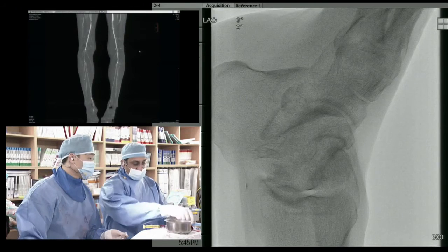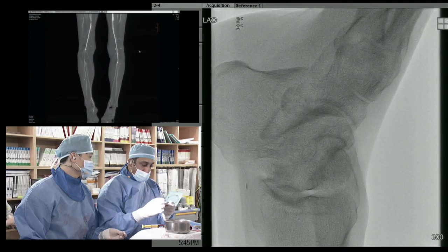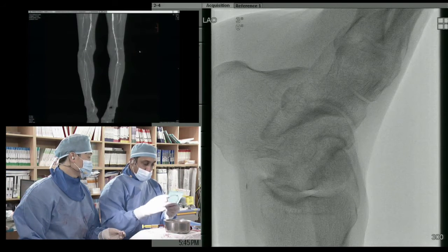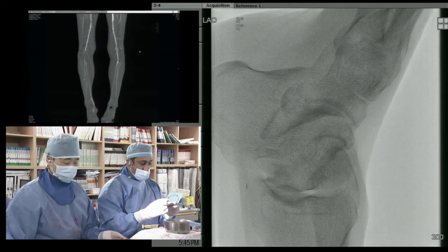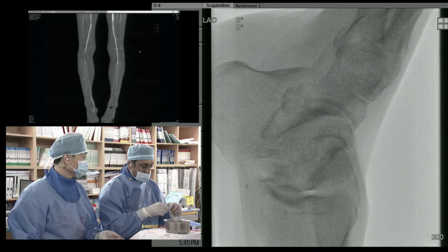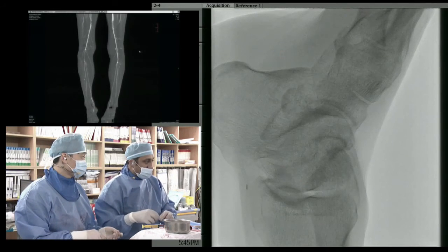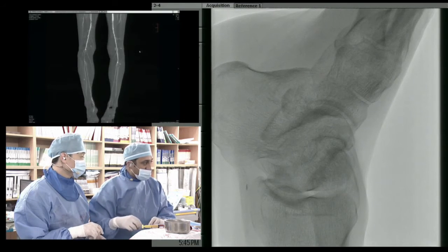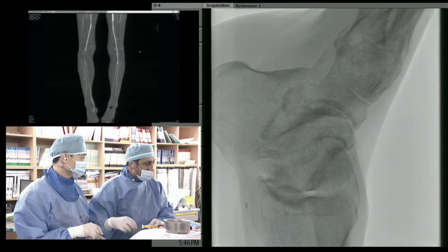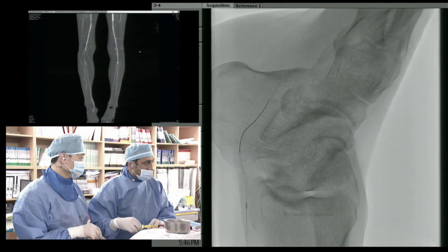I think in our practice you have a couple of options. Why not inject from here? We can see the plantar vessels. I tried to do that, but I'm not getting any flow back, although I've got very good movement of the wire, so I'm pretty sure I'm in the true lumen, but there's just not enough flow in that area. It's moving very easily.